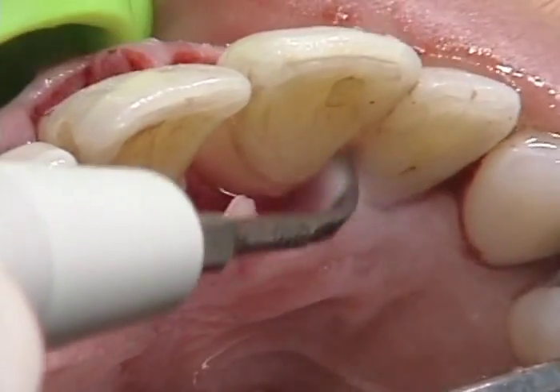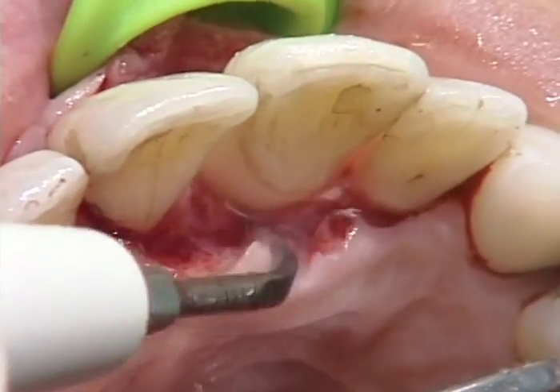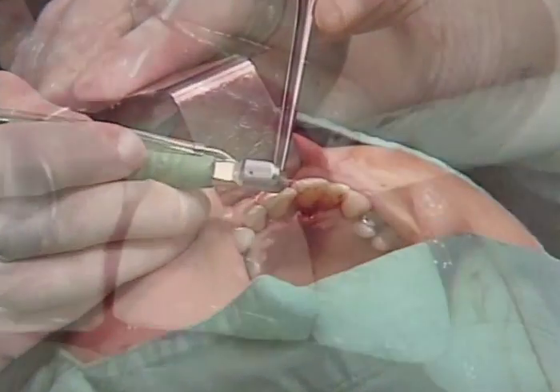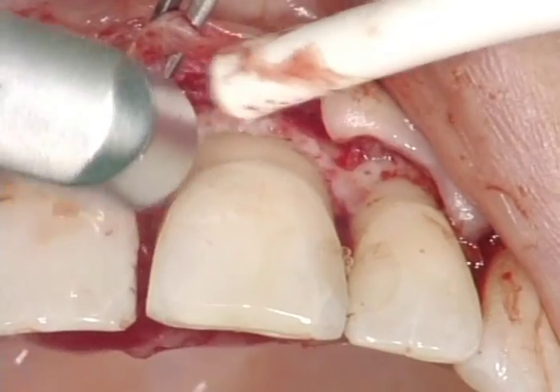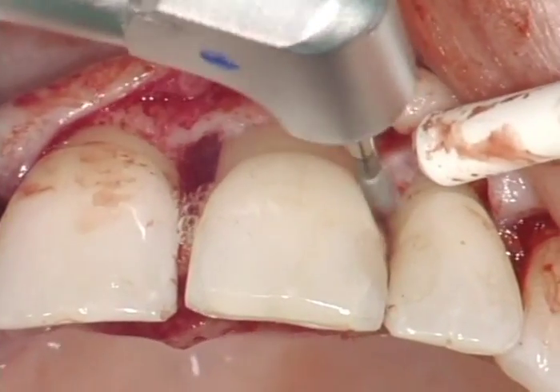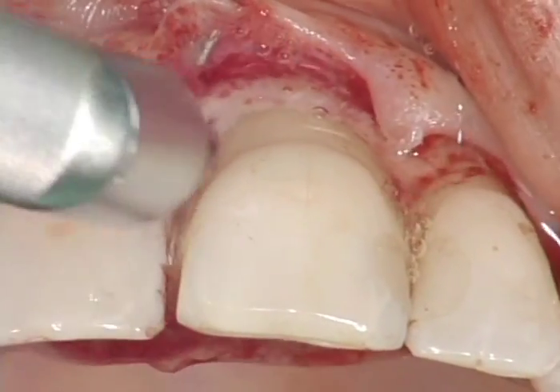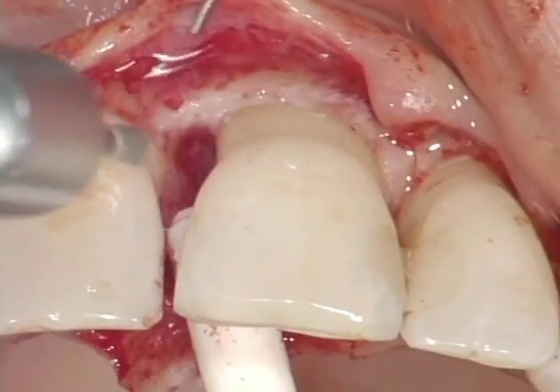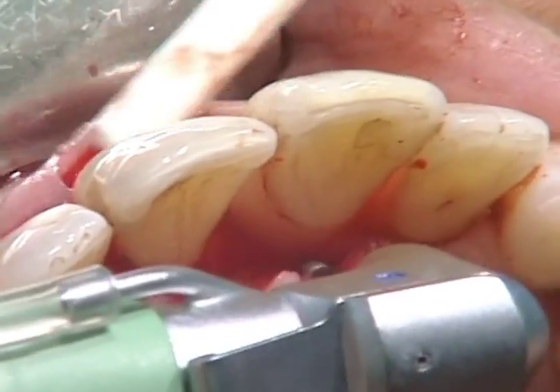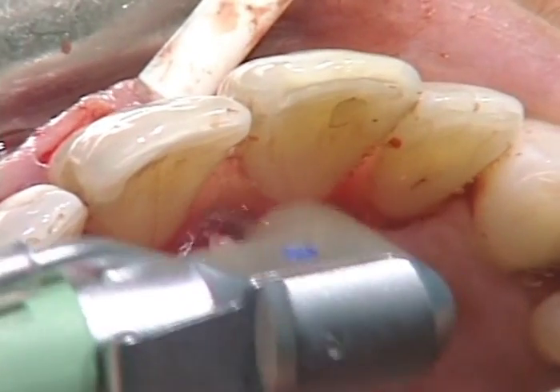The same procedure is applied to the palatal area of the treatment site. In addition to the ultrasound cleaning, the root surface is cleansed and smoothed with the periodontal mill. Residues must be eliminated since they could impair the successful defect treatment with Emdogain. The cleansing with the periodontal mill is also done in the palatal area of the treatment site.